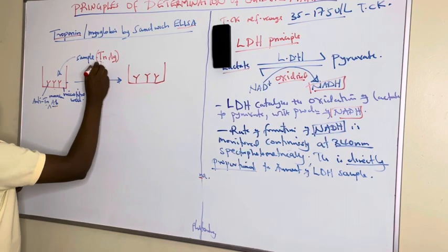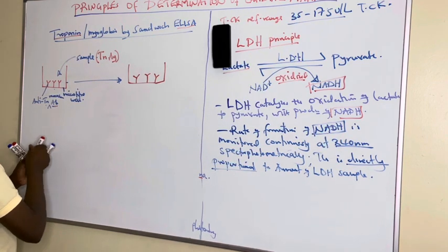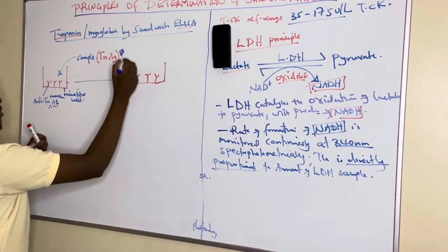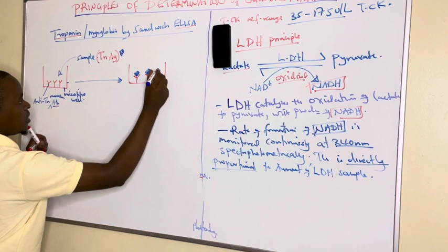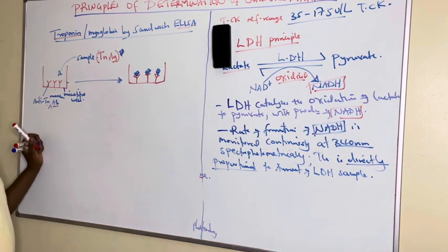In case the sample contains the antigens, they come and bind to the paratopes using their epitopes to the troponin monoclonal antibody.